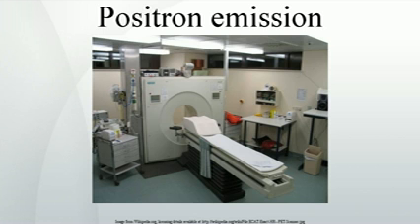Image reconstruction using coincidence statistics. A technique much like the reconstruction of computed tomography, CT, and single-photon emission computed tomography, SPECT, data is more commonly used, although the data set collected in PET is much poorer than CT, so reconstruction techniques are more difficult. See image reconstruction of PET.